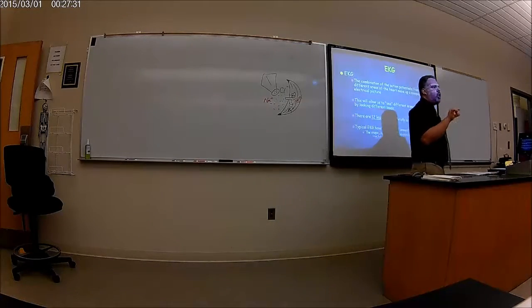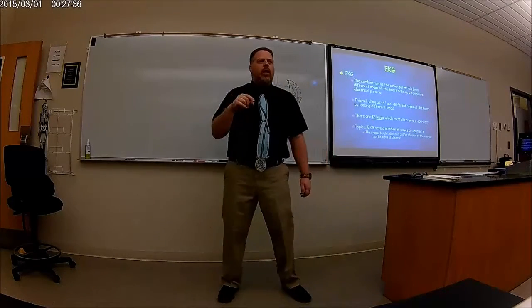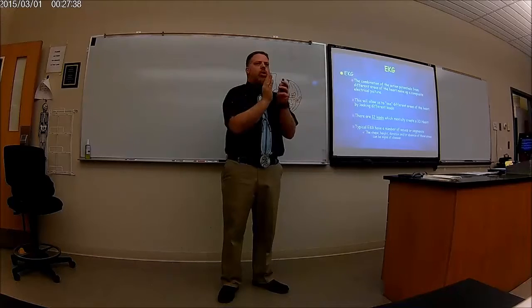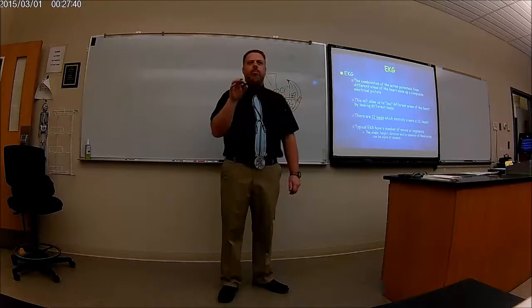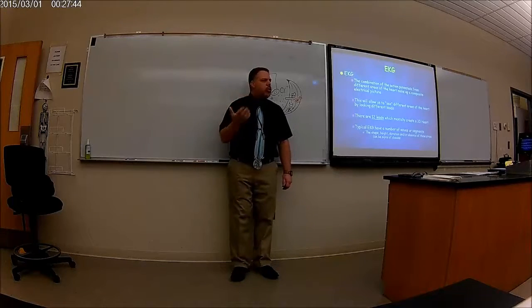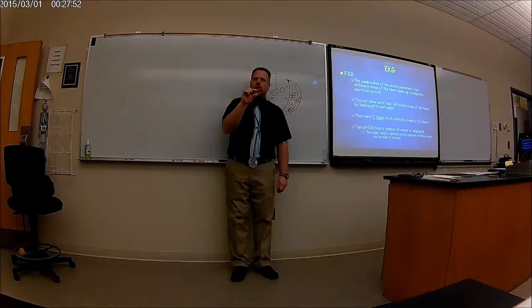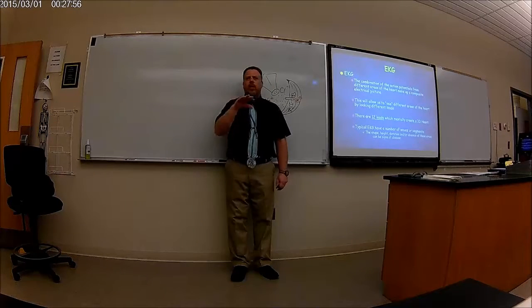And this EKG has a number of waves, we call them complexes, knowing how high they are, how close they are, if they're there, if they're missing, if they're a different shape. That's where cardiologists and nurse practitioners can read that and say, we know what's going on with the heart, because we know what it normally looks like, but this is a little bit too high, so there's probably too much potassium in your blood and things like that.